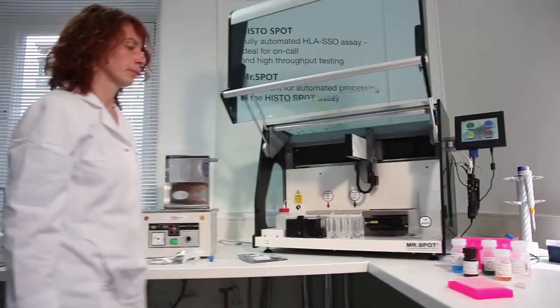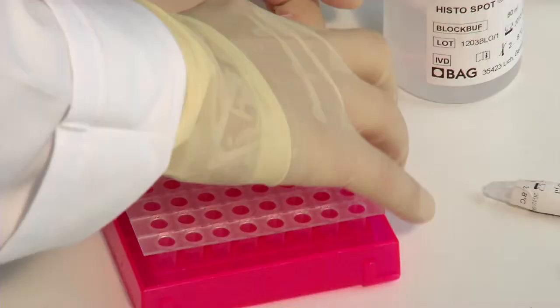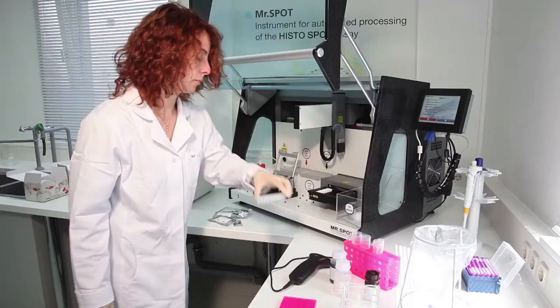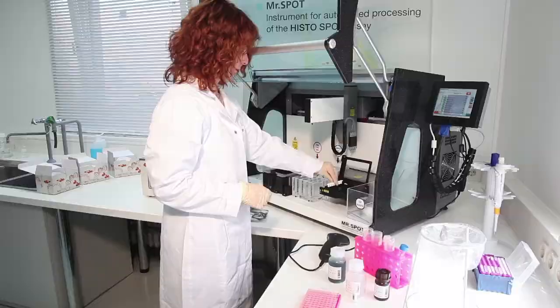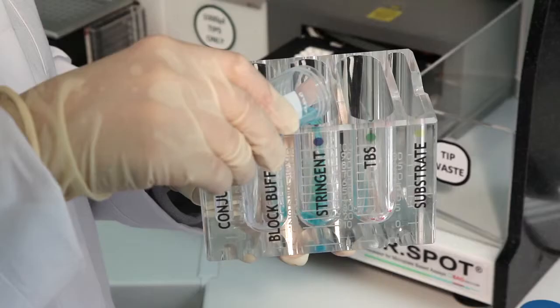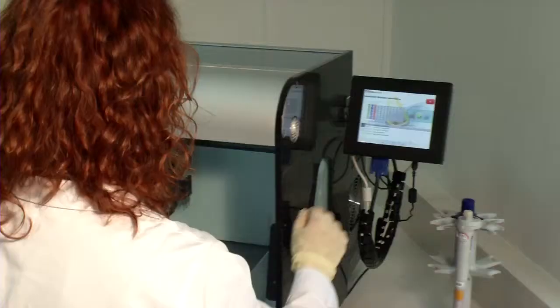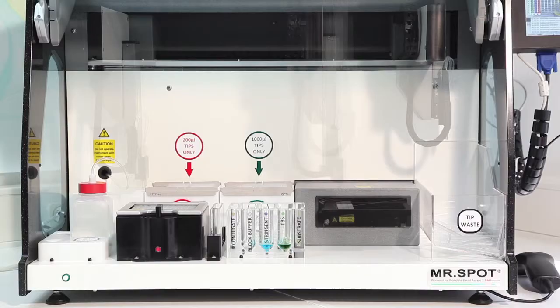Now you have to prepare and start the Mr. Spot processor. To do this, simply follow the instructions on the touch screen. Place the amplicons in the sample block and put the required SSO test wells into the reaction plate holder. Then fill the reagents into the trough. Now you can start the run.